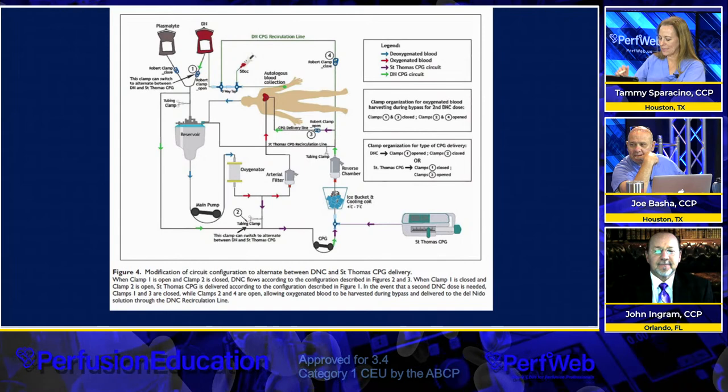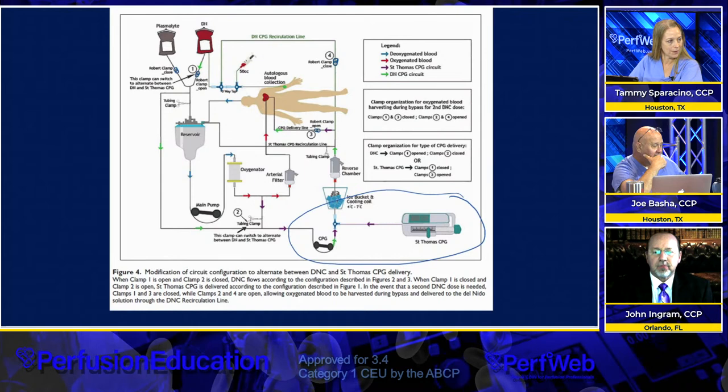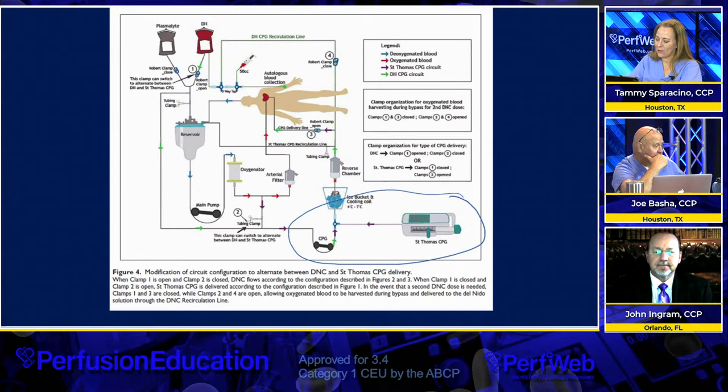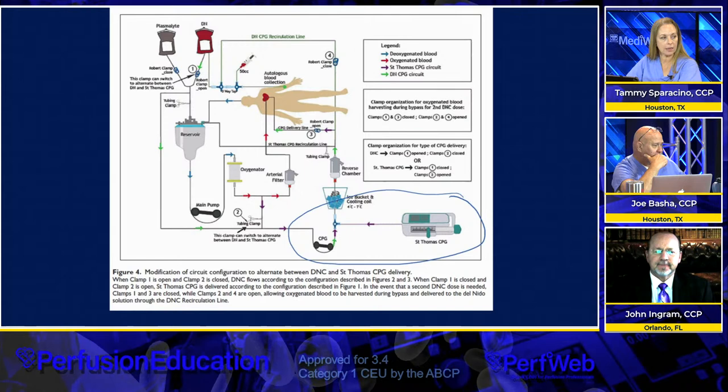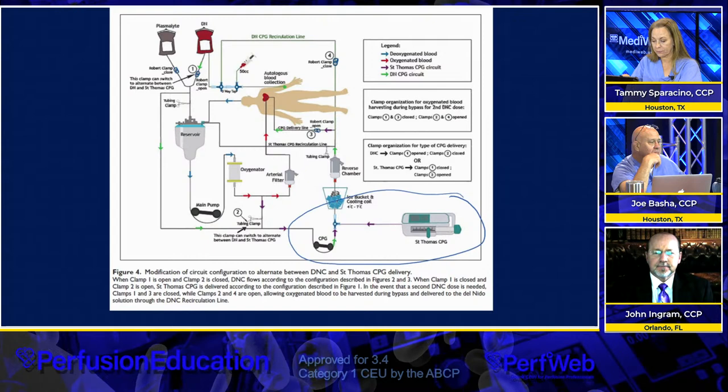That was easy. Okay, so what I want to draw your attention to is this part of the circuit here. You've probably been wondering, what's that syringe pump for? Yeah, I've been wondering that too. I've been still trying to figure this out. So the syringe pump is really not a part of the del-Nido delivery. The syringe pump is an option to be able to give, in their case, St. Thomas cardioplegia.